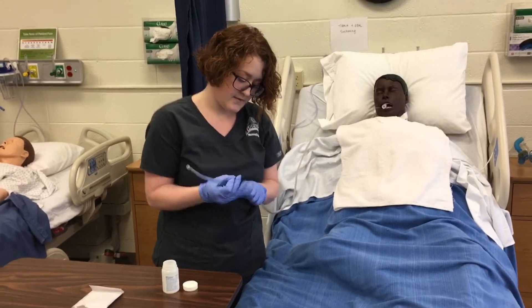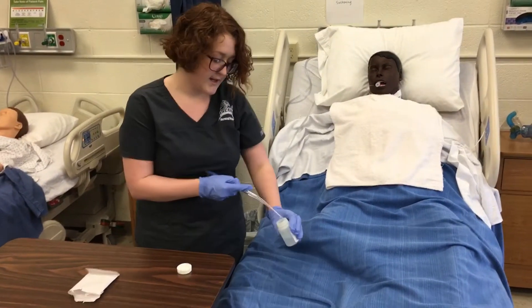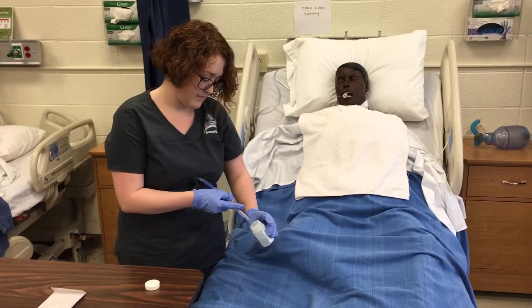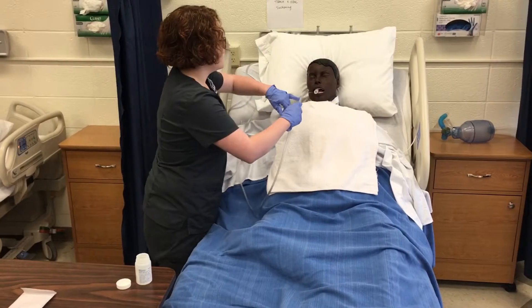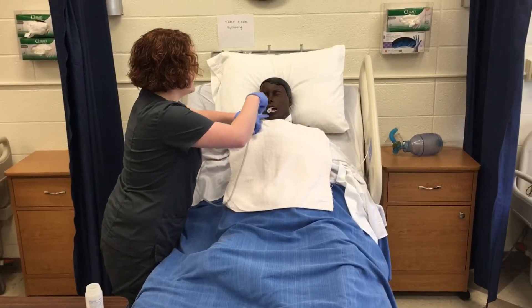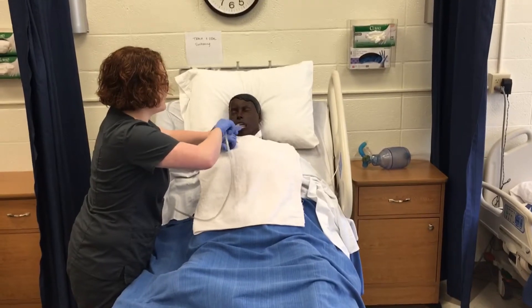I'm going to connect it, and then I'm going to lubricate the tip. Then I'm going to go in alongside the teeth and the mouth and just perform oral suctioning.